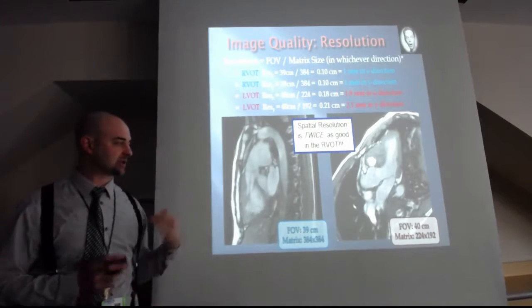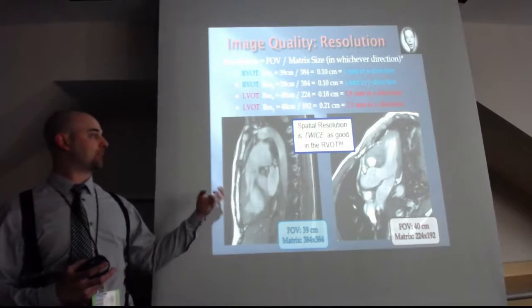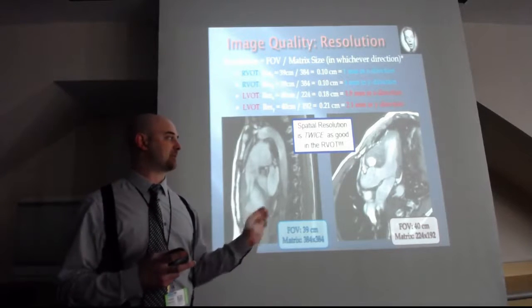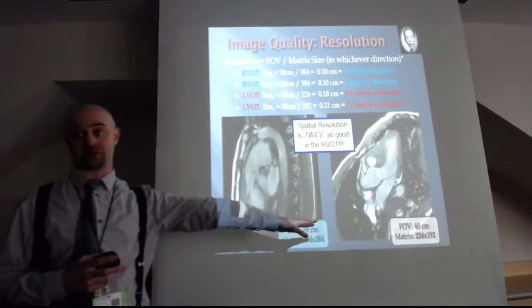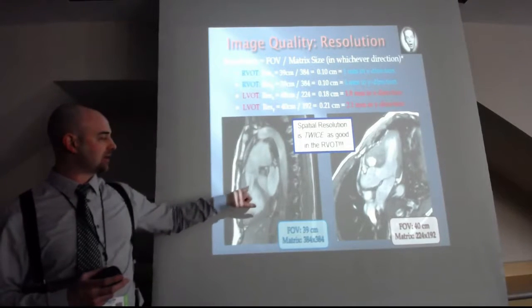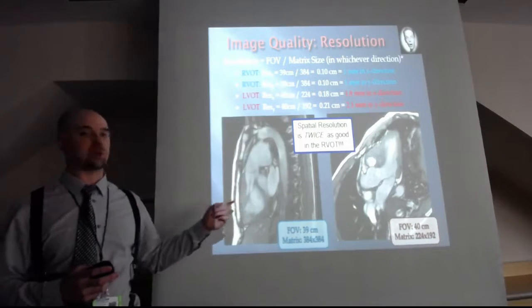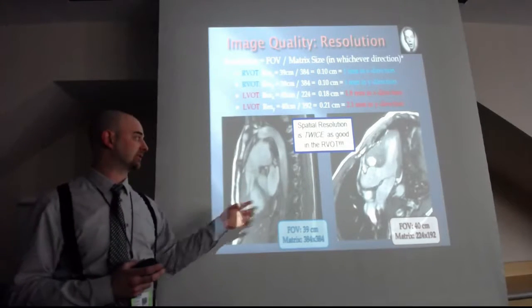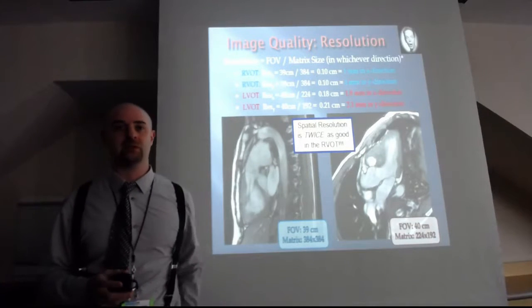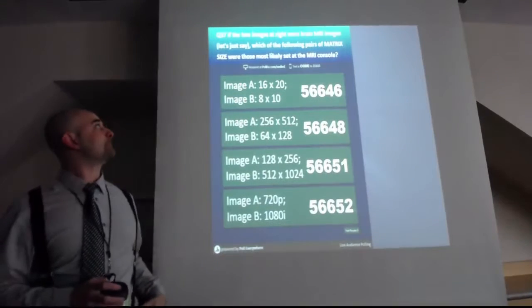And I want you to just kind of look at these two pictures and internalize. This is almost like when we were looking at the night vision goggles, this is the opposite, where this is a difference in spatial resolution, not really signal to noise. And you can just tell that the edges are a lot sharper here than they are here. You just feel like if there was some tiny element you were looking for, you'd be better off finding it in the RVOT on the left. Okay? Questions? Okay. All right.